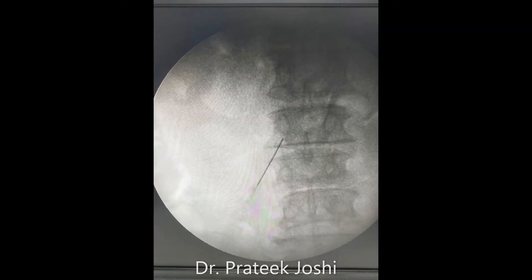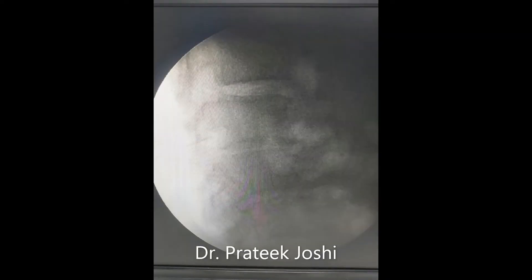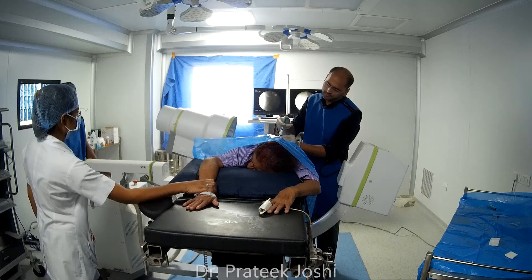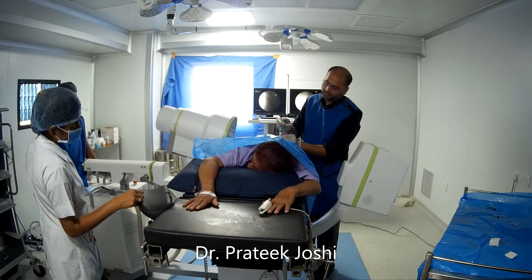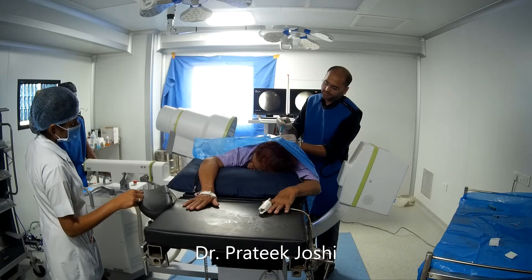Once we are in the correct space, the patient might feel a shock-like sensation in the lower limb. Then we inject a diluted local anesthetic agent mixed with triamcinolone slowly.